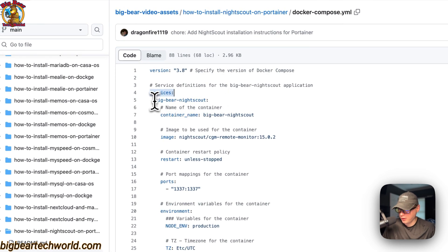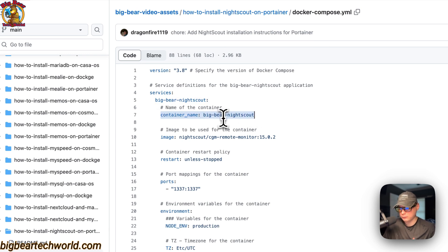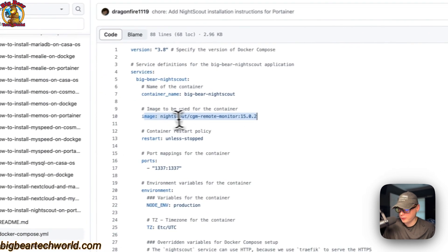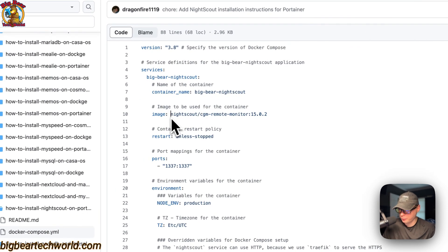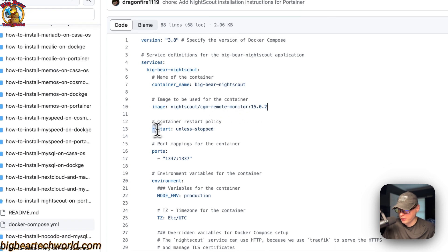The first service under services is called 'big-bear-nightscout' and the container name is also 'big-bear-nightscout' — this prevents Docker from generating a random name. The image is coming from Docker Hub by default since there's no URL prefix, and this is the Docker image tag. The restart policy is set to 'unless-stopped', so if you stop it manually it won't restart, but if it fails for any other reason it will.